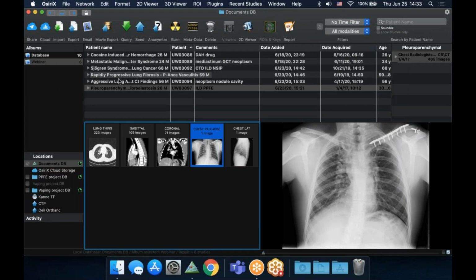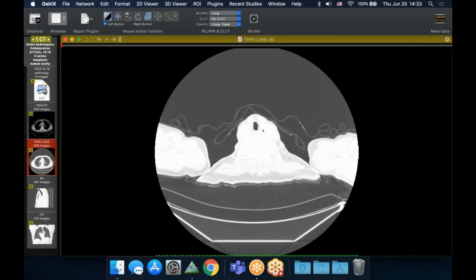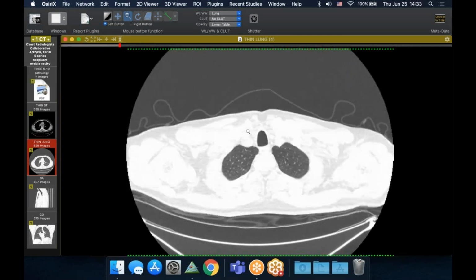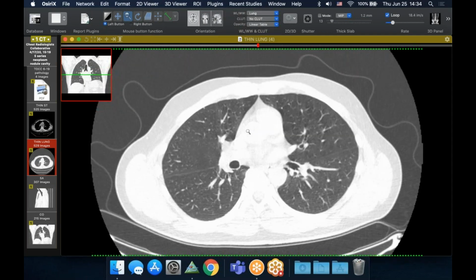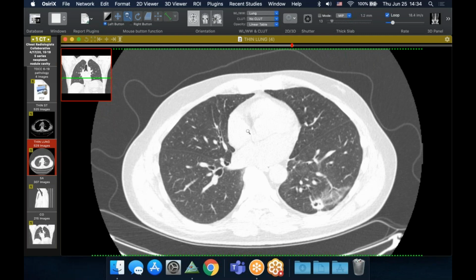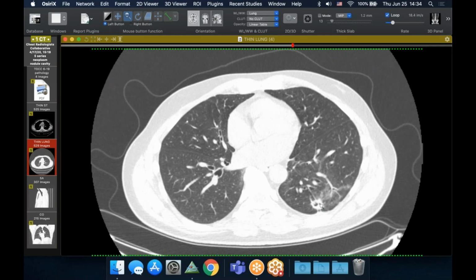And then we got some time, so I'll show this case. This is kind of cool. This is a case where the imaging is pretty boring, but the pathology is quite fascinating. So this is a patient who I think had an incidentally detected lung nodule, fairly young patient, had a smoking history, and had this sort of cavitary nodule here in the left lower lobe. It has this funny atelectasis, almost looks like someone tried to radiate it, but that's not the case. But it looks like an early lung cancer.